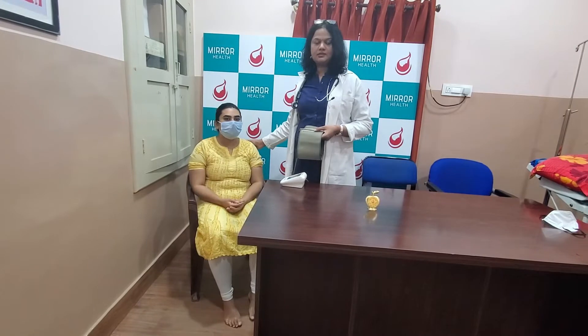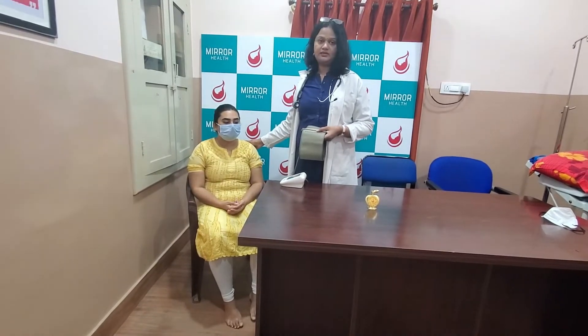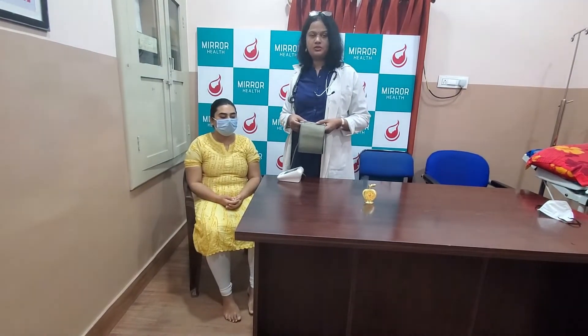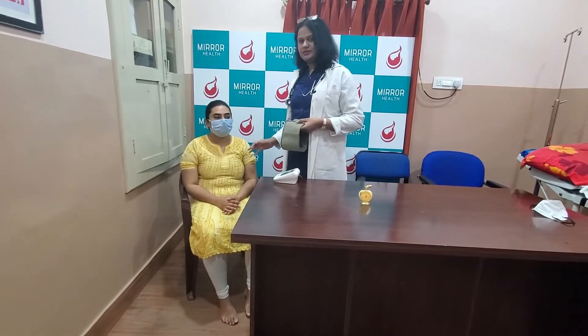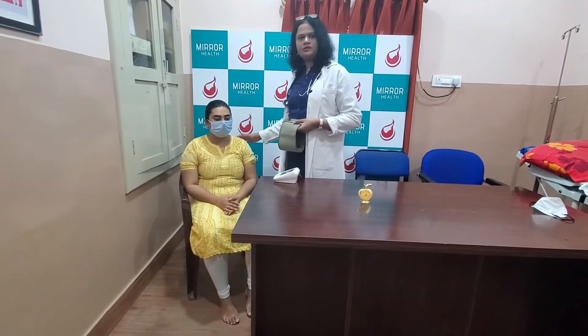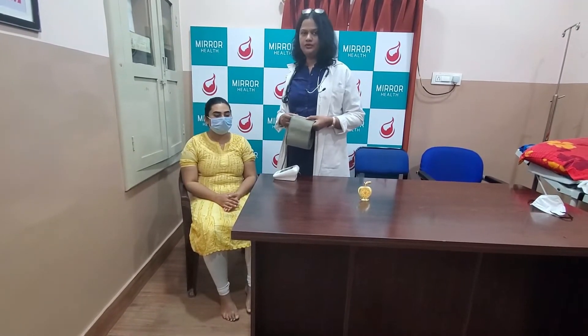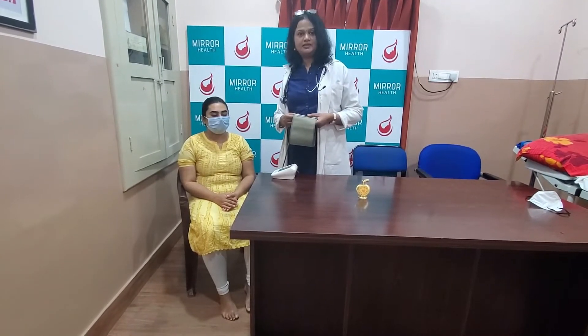Here I am with Mrs. X, who has walked into my antenatal clinic. She walked into my clinic about 5 minutes before I started to measure her blood pressure. You can see that she is absolutely comfortable. She is seated with her feet on the ground and she is absolutely relaxed, with her back as well as her arms well supported on a very properly and comfortably placed chair.